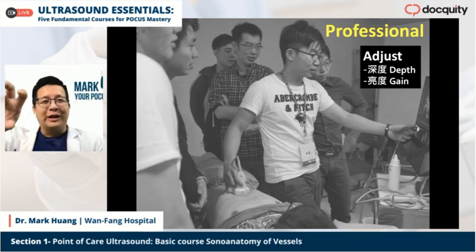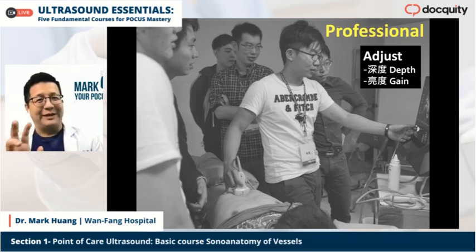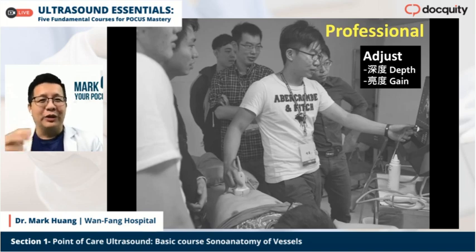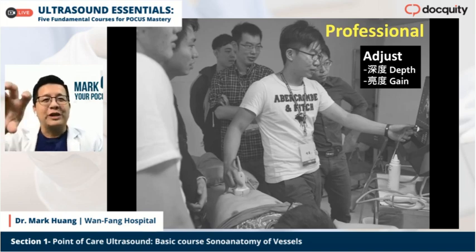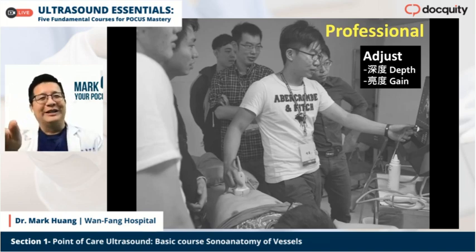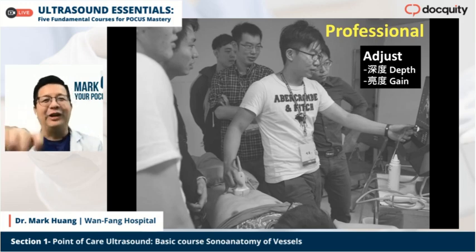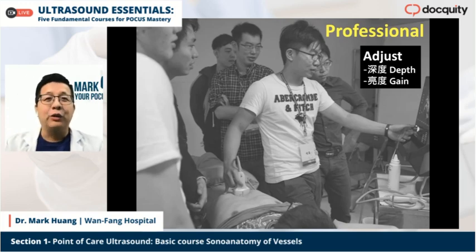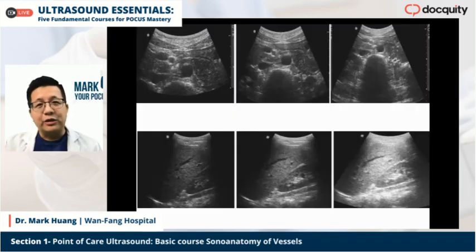So you need to look like a professional person. When you can use these two buttons, it's very useful, and you look professional. You just turn the depth up and turn it back. When you do something on your controller, it makes you look better, and you will start to have confidence. These two buttons are also very important and very basic.